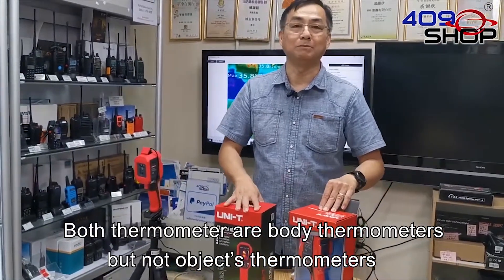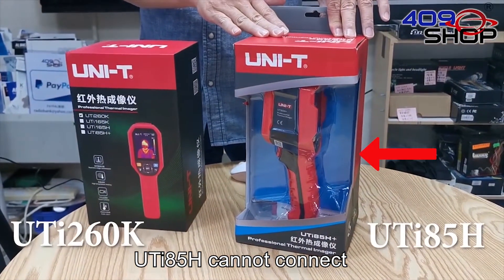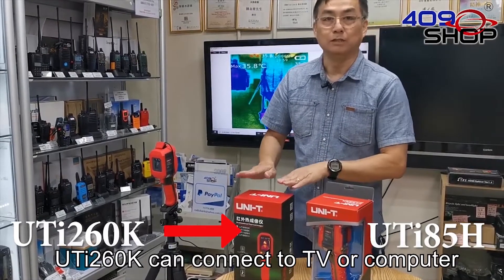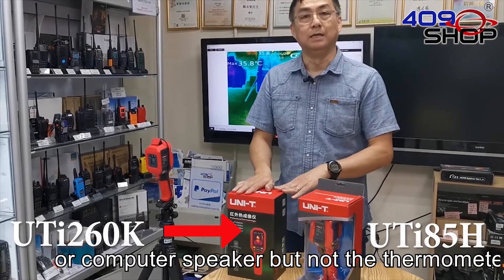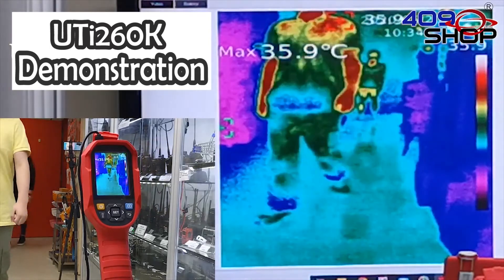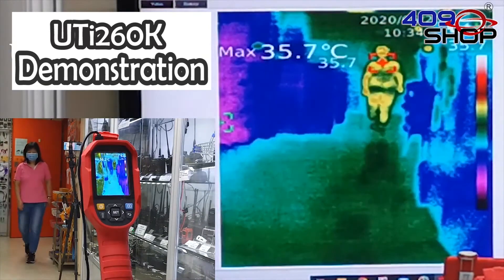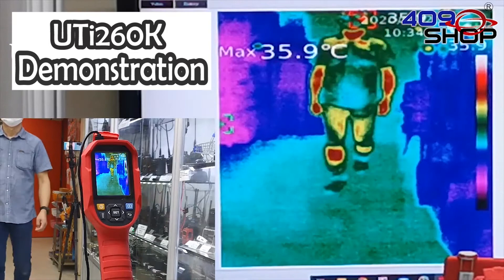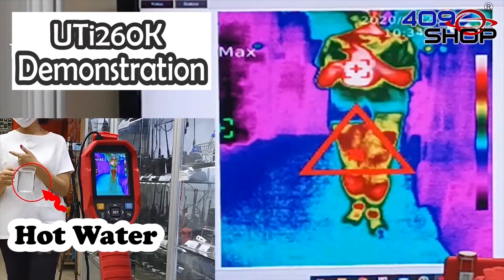Both thermometers are body thermometers, not object thermometers. But what's the difference between them? The UTI-85H cannot connect to the TV or computer and the sound is produced by the thermometer itself. The UTI-260K can connect to the TV or computer and the sound is made through the TV or computer speaker, not the thermometer. I'm going to show you later.